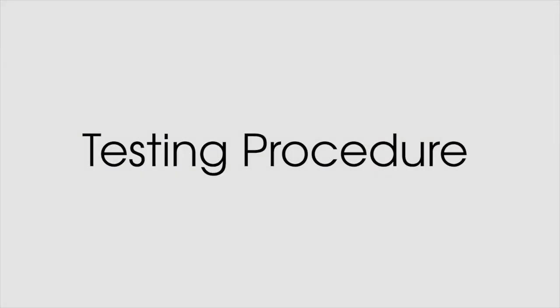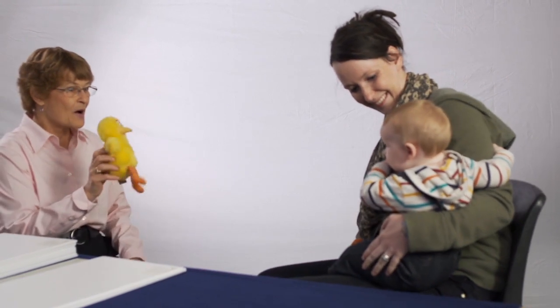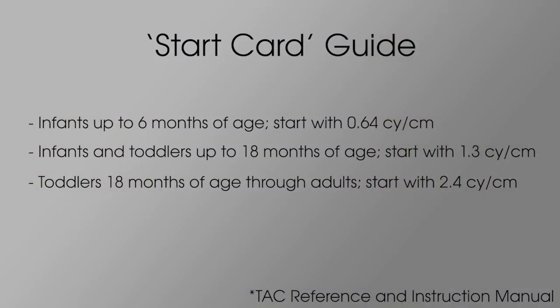This section illustrates the complete sequence of testing a child's visual acuity with Teller acuity cards. Young patients are usually seated on their parent's lap, and the parent or holder should be cautioned not to give the child any guidance during testing. Based on the patient's age, determine the start card for testing. Consult the Teller acuity card reference and instruction manual. If the patient is visually impaired, a coarser grating than that based on age may be needed for the start card.